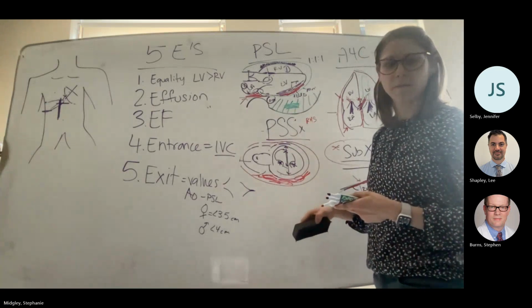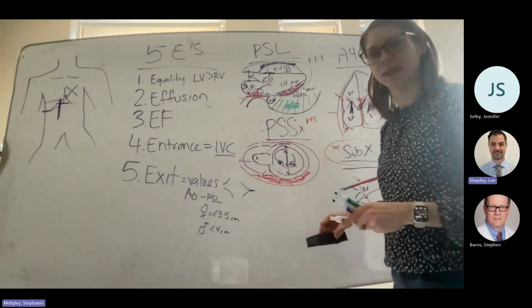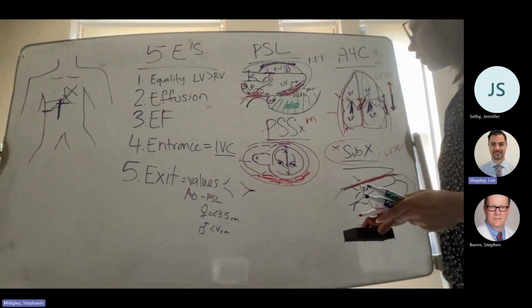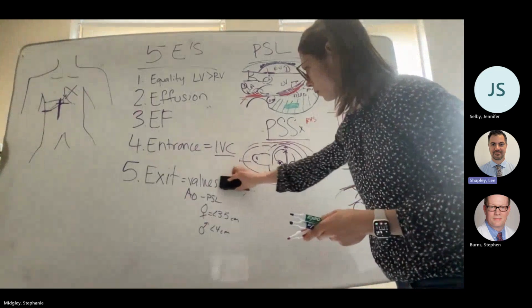Any questions? I have a good question. Yes, I love questions. When you come back to your pericardial effusions, not every effusion is just fluid.